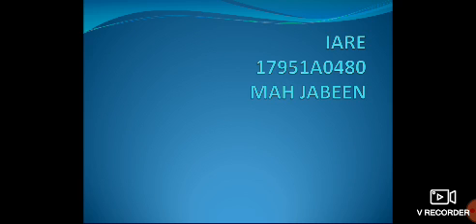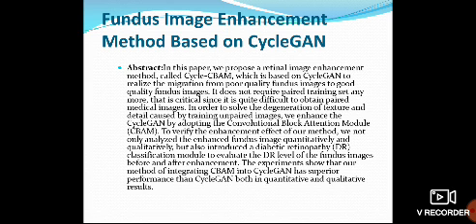I'm going to discuss a fundus image enhancement method based on CycleGAN. Here is the abstract. It is a retinal image enhancement method, also called Cycle-CBAM, which is based on CycleGAN, to realize a migration from poor quality fundus images to good quality fundus images.